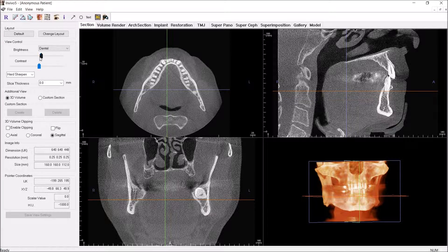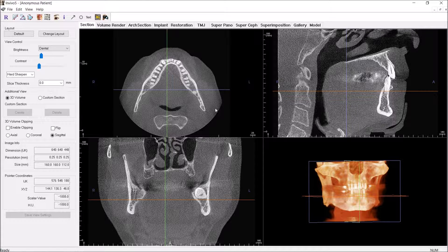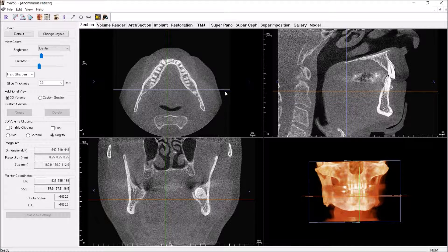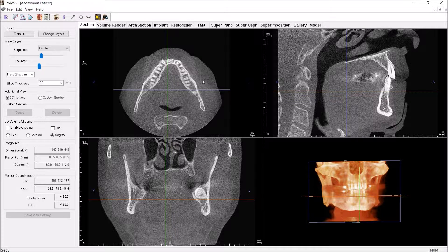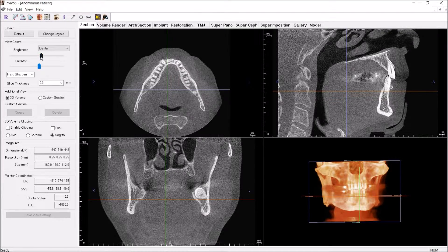Then you adjust the brightness and contrast. That looks pretty good for what we're looking at, which is mostly hard tissues. You do see a little bit of the soft tissue contrast between the layers of fat, loose connective tissue, and muscle.